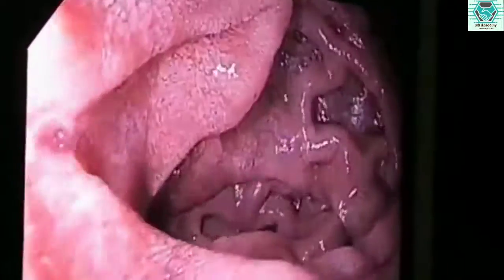Upper GI endoscopy, or EGD, is a procedure to diagnose and treat problems in the upper GI tract, and it includes the food pipe, that is the esophagus, the stomach, and the first part of the small intestine, that is the duodenum. So these basic parts are included in the upper GI endoscopy.